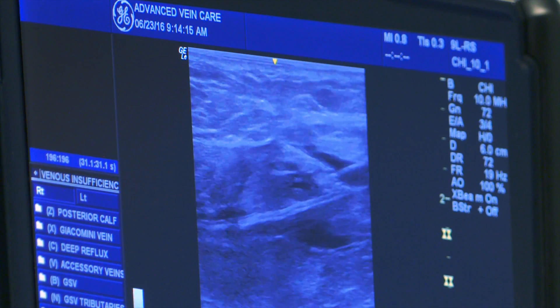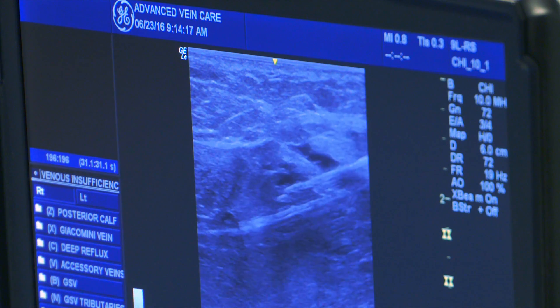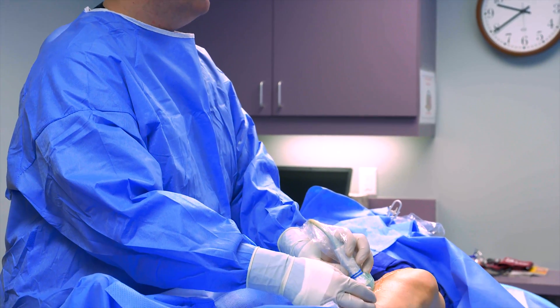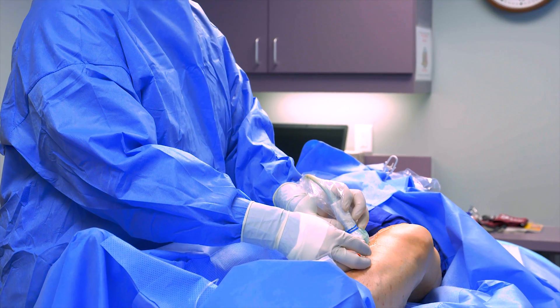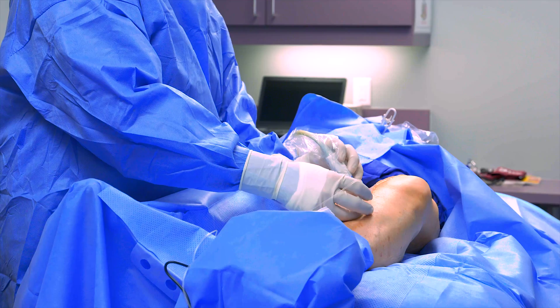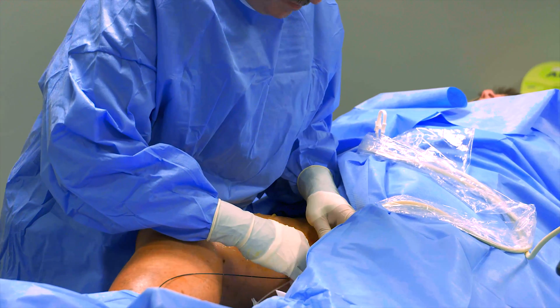Dr. Faber will then confirm by ultrasound that the catheter or fiber is in the correct position. The next step is to inject tumescent anesthesia into the tissue surrounding the vein. This helps separate the vein from surrounding tissues, it prevents damage to the skin from the heat used in the procedure, and provides pain relief during the procedure.